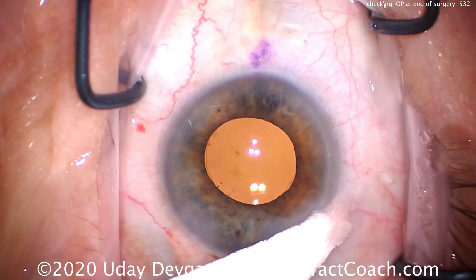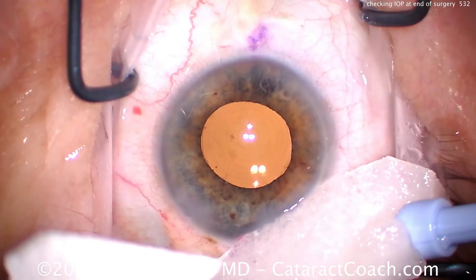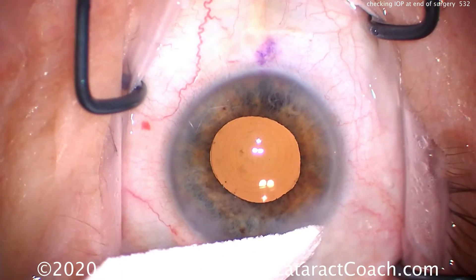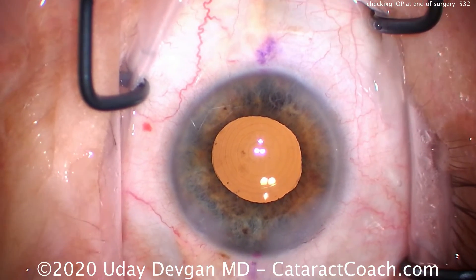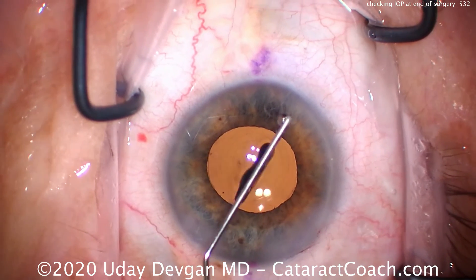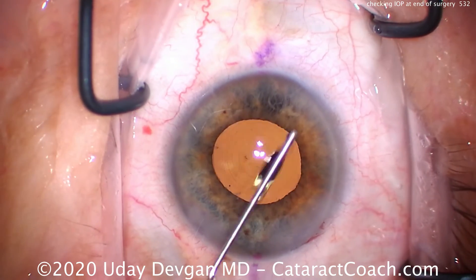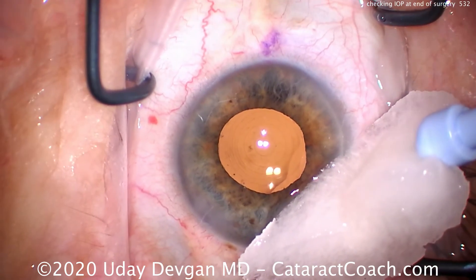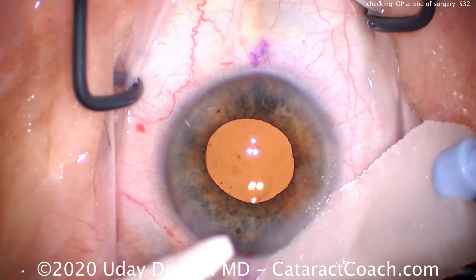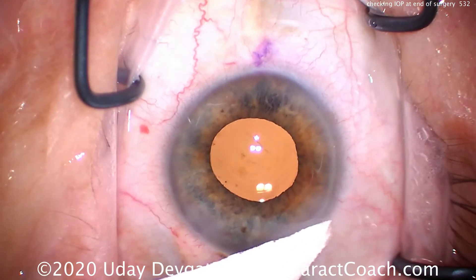Look at the tip of the sponge — it slightly leaks. I'll try that again. When I put the dry sponge here, look how the tip of the sponge expands. That tells me there's still a little leak there, so probably we need to adjust the pressure. Touching it, it's very firm. Let's release a little pressure. Now that looks better — more physiologic. Let's check the incision one more time. And now no more leak. It looks great.